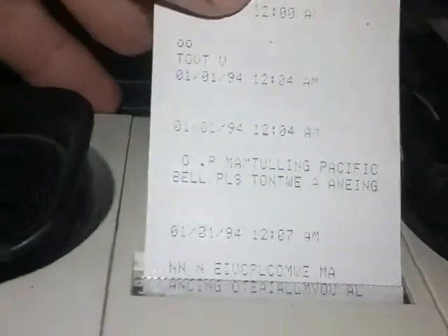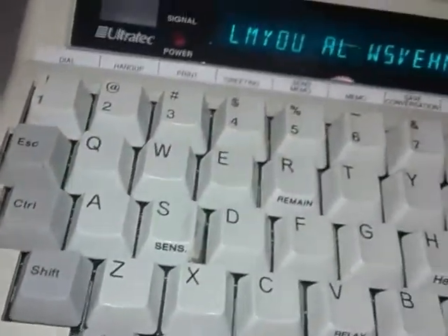Alright, well it printed out 'sound' — didn't do a real good job because I was just force-feeding it some sound. But you can see that the tones are converted — the words are converted into tones — and with this device you have one on each end, and a deaf person could talk to another deaf person or a hearing person.